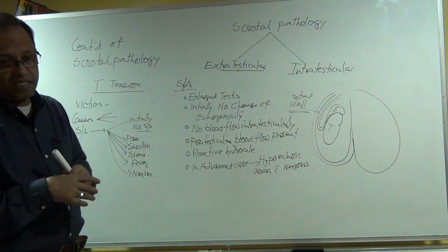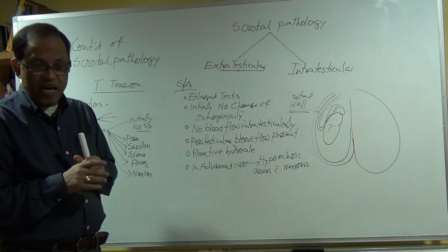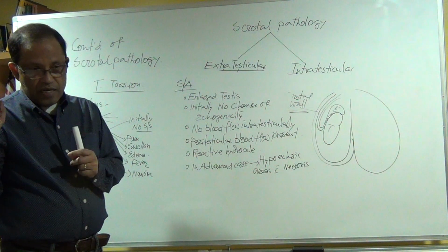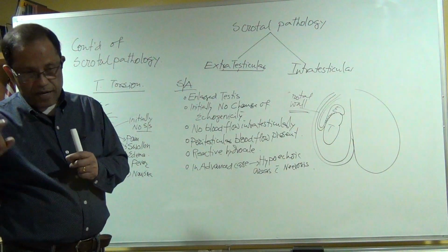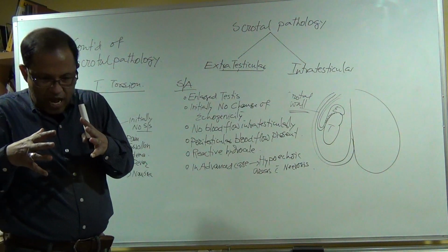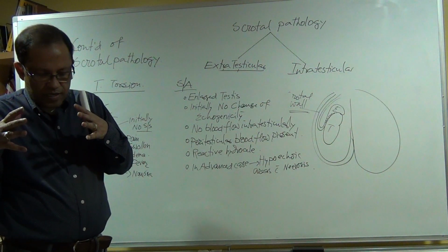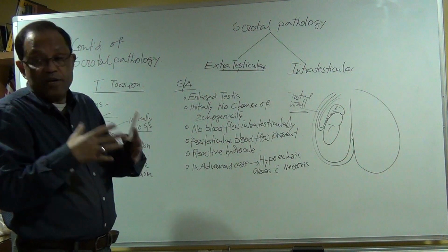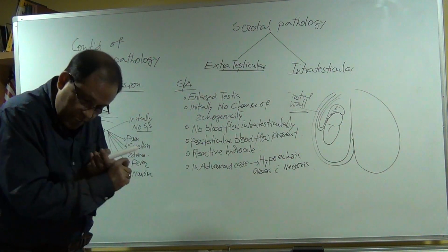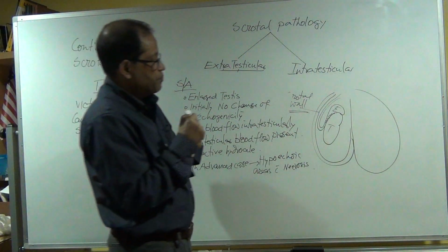Nuclear medicine test to check the cellular function. So, ultrasound, gray scale, Doppler plus nuclear medicine test, all are, it is called, they can rule out the testicular torsion. If nuclear medicine, let me show you.